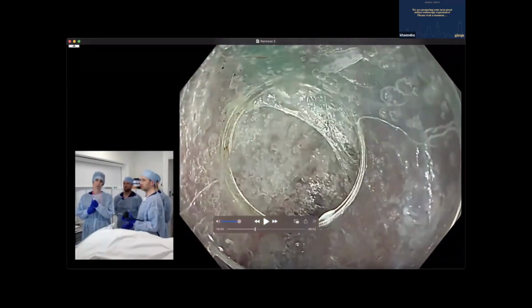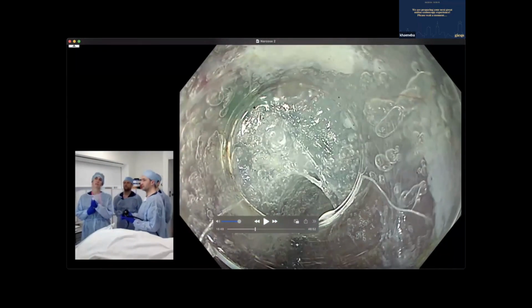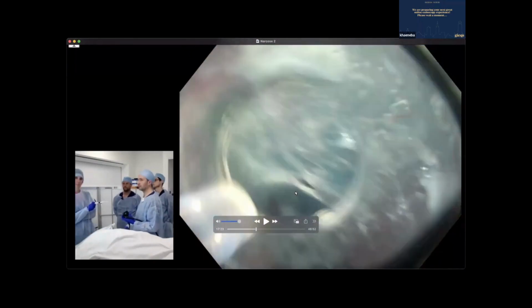This was the answer, right? Because now there's a light, and I also know where that is, right? So I know that this way, up here, is normal mucosa, and the lesion must be here because of where I put that. It must be here because this is cranial, this is caudal. I know that. So I also kind of know I'm underneath it. So, okay, I'll just do a little bit more, freeing the edges.